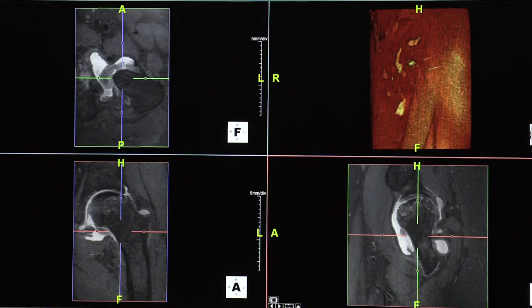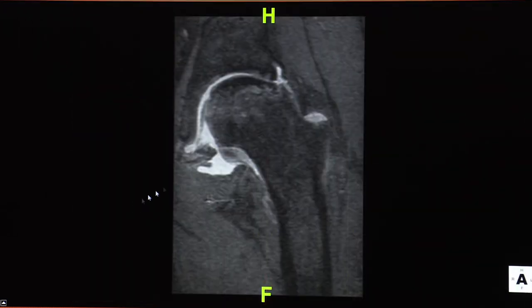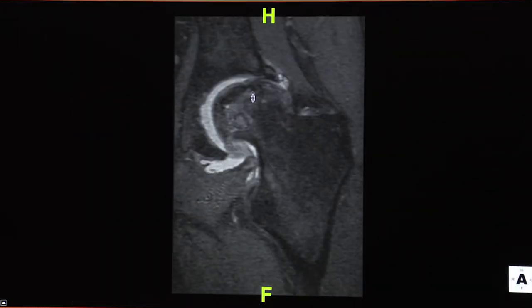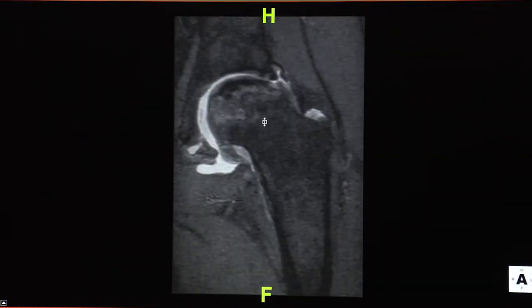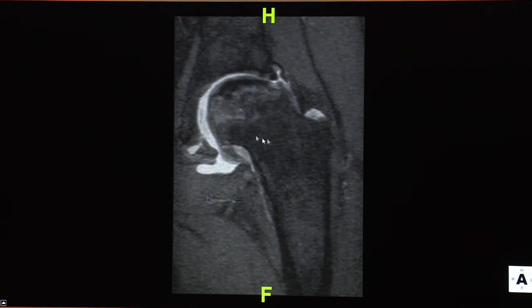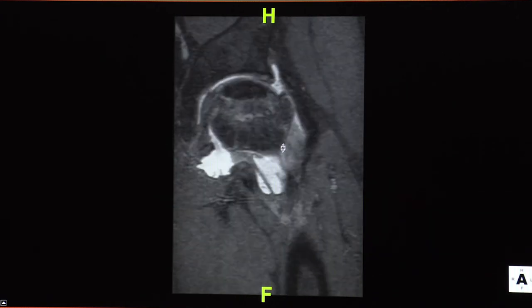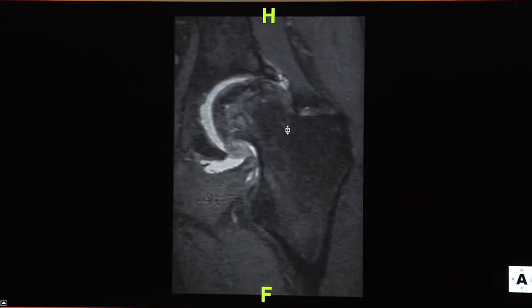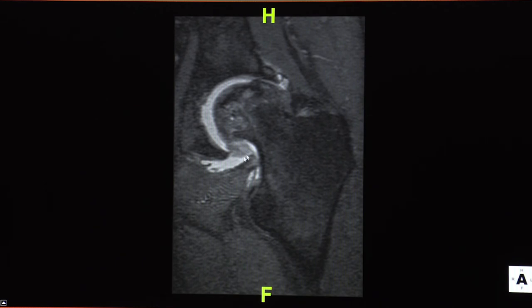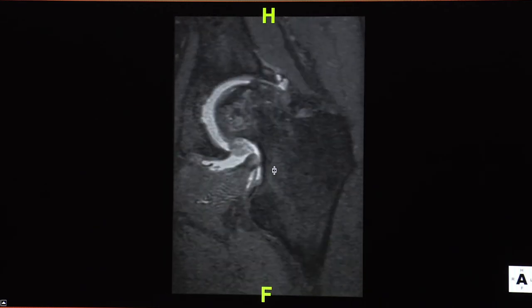Next we'll move to the hip. This is 3D SPACE imaging at 0.7 mm isotropic. Starting with the coronal image, you can see the cartilage and a lesion in the femoral head — a big lesion collapsing the head with a fracture — that's AVN Ficat stage 3. You can also see quite a bit of synovial thickening along the inferior plica; plicae are very nicely seen on 3D.